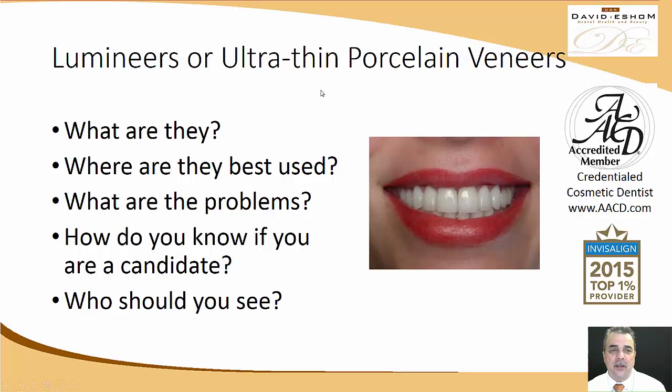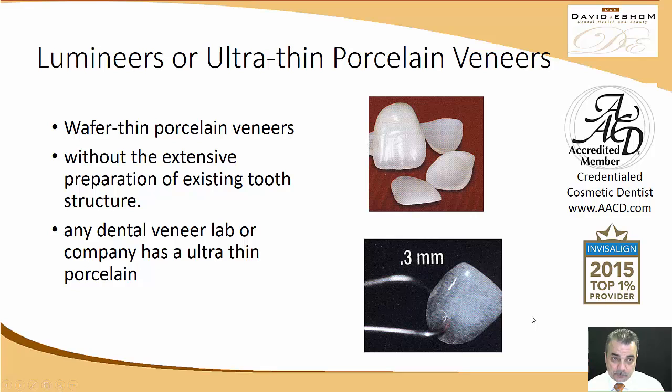But in today's video, we're going to tell you what Lumineers are, where they are best used, what could be their problems, and how you know if you're a candidate for something like Lumineers or Prepless veneers, and then who you should see to have your smile done possibly with Prepless or Lumineer type veneers.